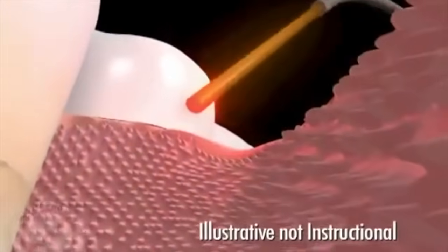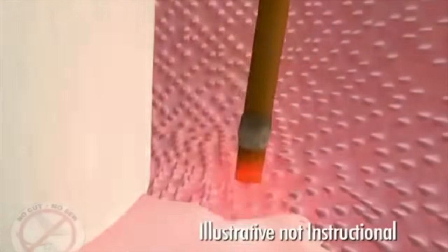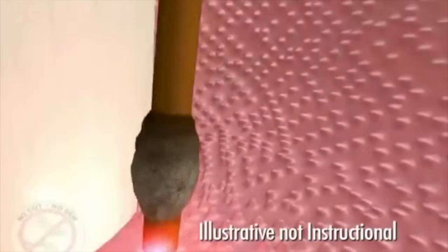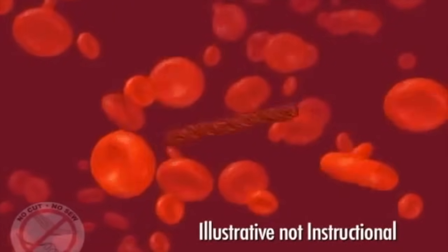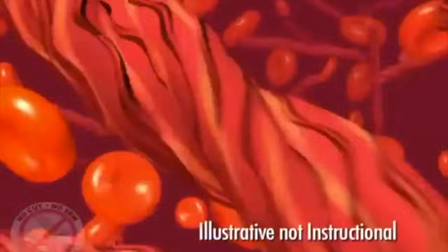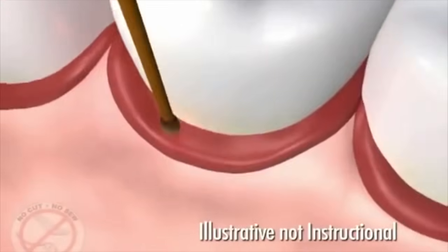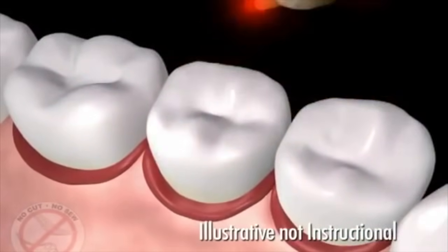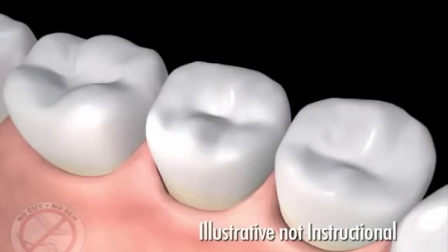Then the laser is used again at the bottom of the pocket to remove any remaining diseased tissue. This pass of the laser also sterilizes the tissue and bone and completely eliminates the bad bacteria, germs, and toxins. It also stimulates the formation of a blood clot, which, once formed, contains fibers that reattach the tissue to the tooth and seal out debris and bacteria like stitches would, and create the right environment to cause the bone and other soft tissues lost from the disease to actually grow back.